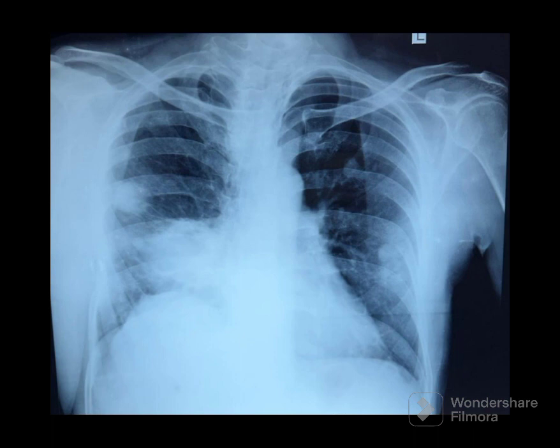The nodular lesions in the left lung — the contralateral lung — would be considered distant metastasis and receive a scoring of M1a. Based on this chest X-ray, the likely staging would be T4, nodal status unknown, and M1a.